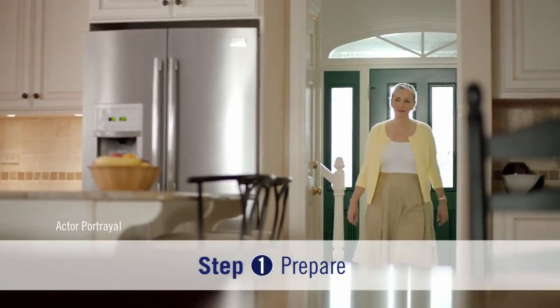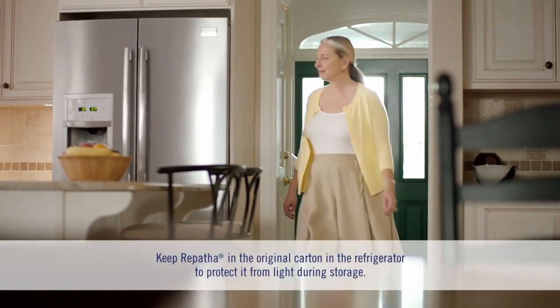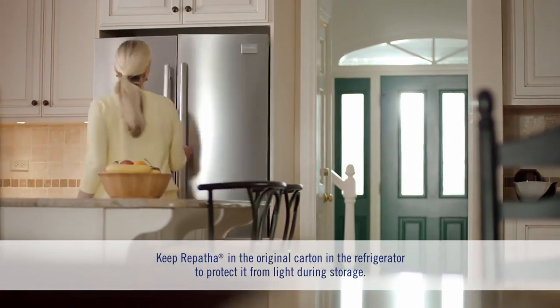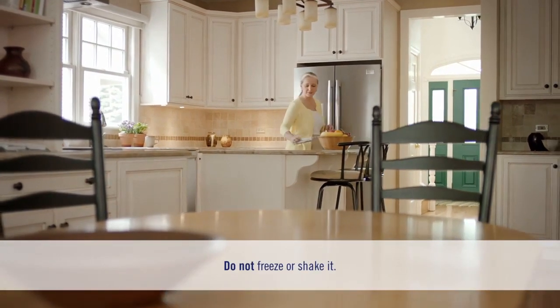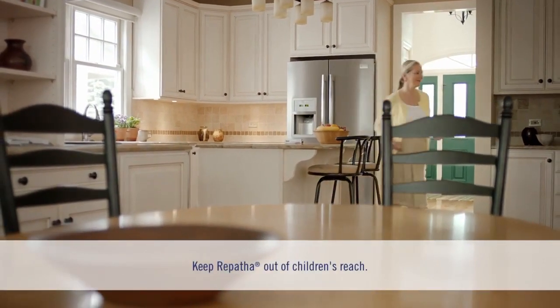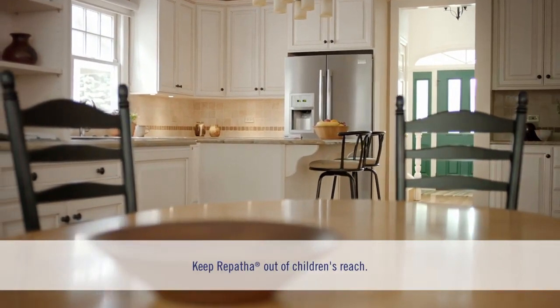First, it's important to store Repatha the right way. That means keeping it refrigerated in its original box. Don't freeze or shake it. And remember to keep Repatha out of children's reach, like you would with any medicine.